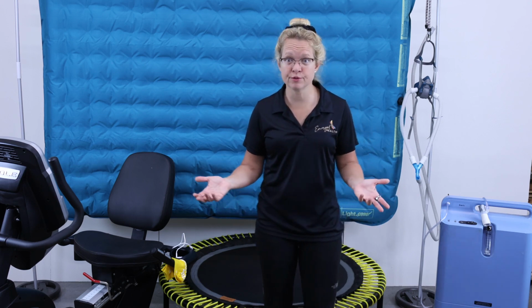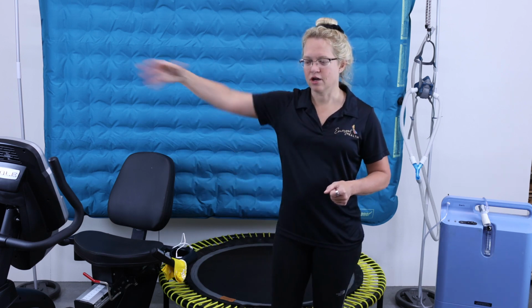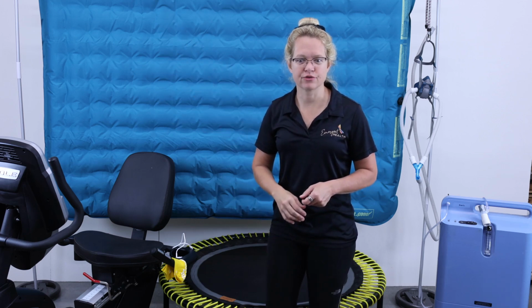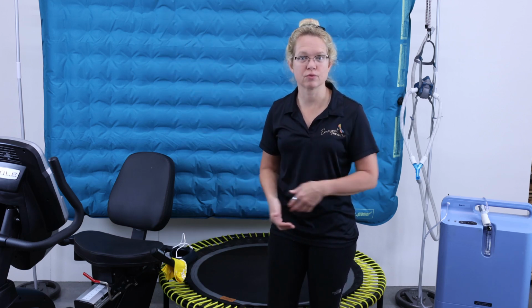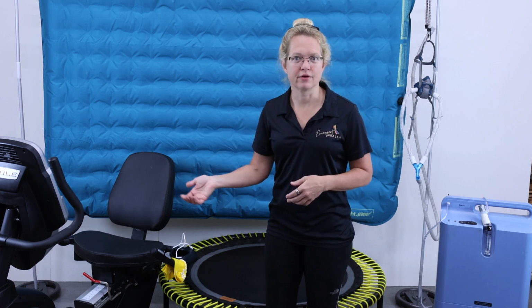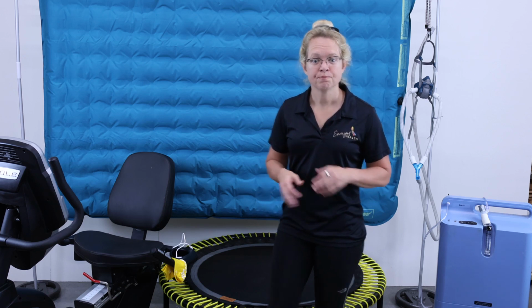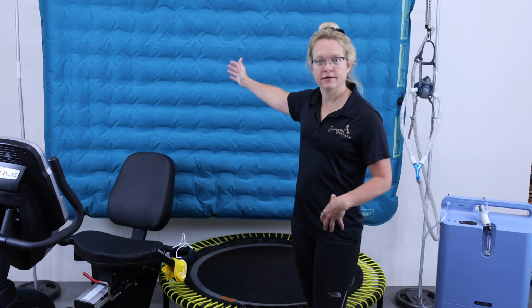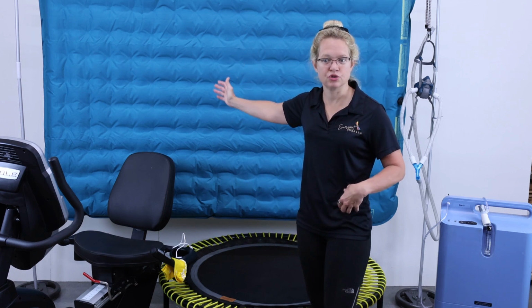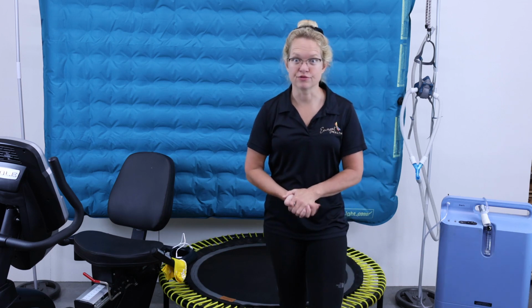That's never been proved. The people I know who've used it say that they just let it off-gas outside for a while. They hang it up over a railing at their house or on their porch for a week or so, turn it inside out and let it air out again, and then they use it and they don't smell any plastic. But that's up to you. I used a TPU lined polyvinyl air mattress because it's the same material as used by the very expensive $300 bags that are used for EWOT systems.